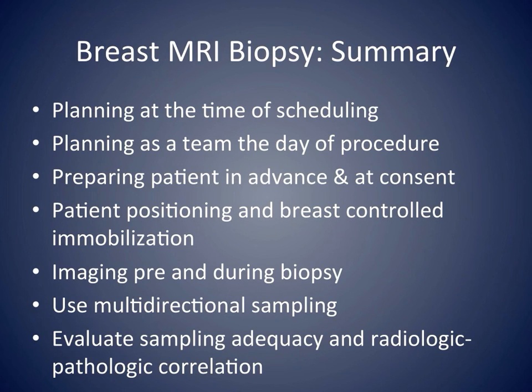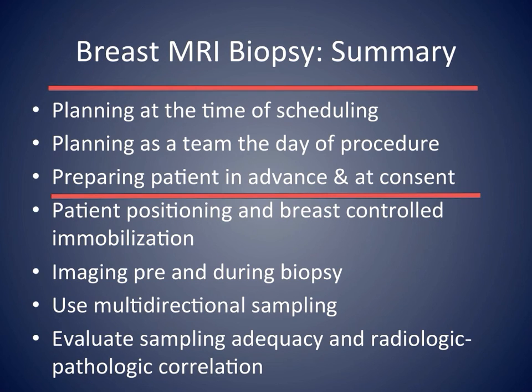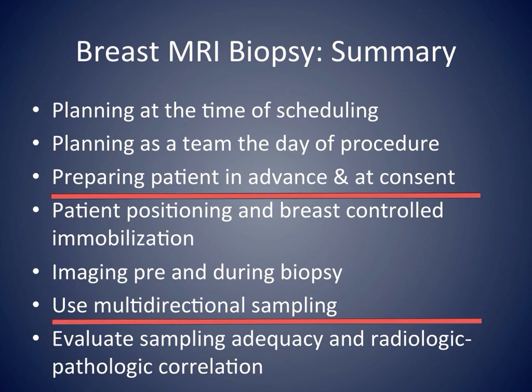In summary, breast MR biopsy is a complex procedure that requires multiple steps. Preliminary steps involve planning at the time of scheduling and the day of the procedure to prepare the patient and the team for the biopsy. The success of the procedure is dependent on patient positioning and controlled immobilization of the breast, imaging, and vacuum-assisted biopsy device.